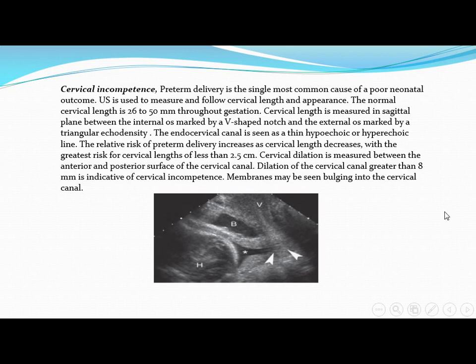It is the whole thing of the cervical canal. Only this part is closed, still closed. So you measure this one. You can't measure the whole thing. The whole cervix is 35 millimeters and then you cannot do that. Yes.